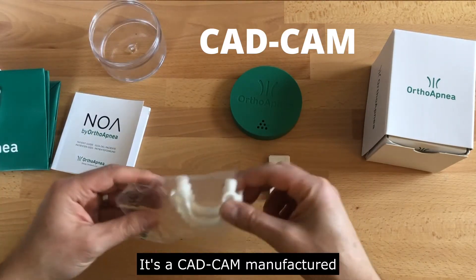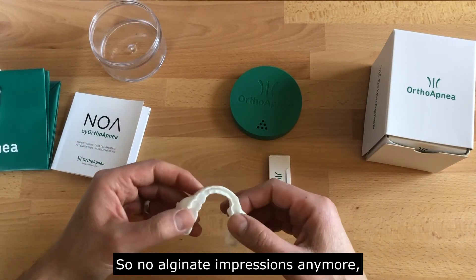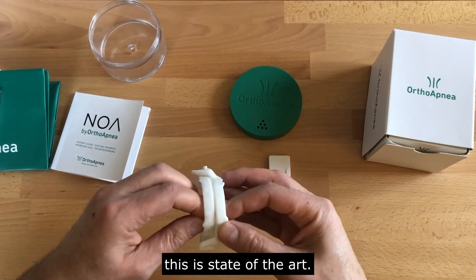It's a CAD-CAM manufactured mandibular advancement device made from intraoral scans — no sort of alginate impressions anymore. This is state-of-the-art.